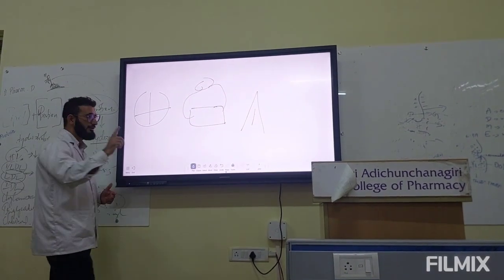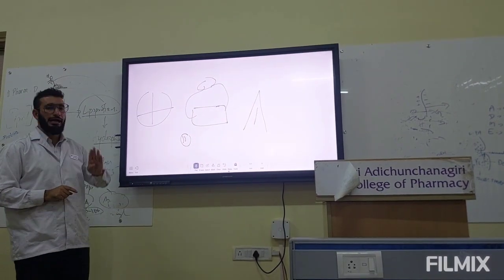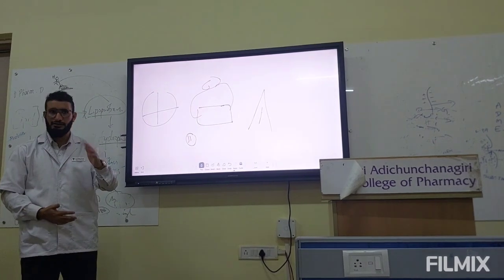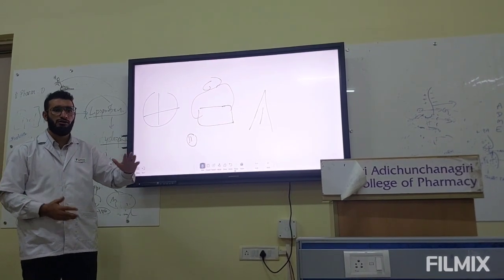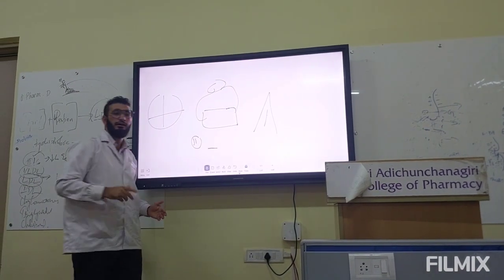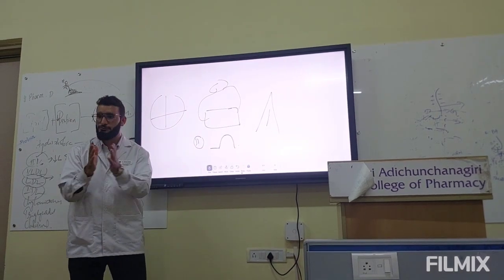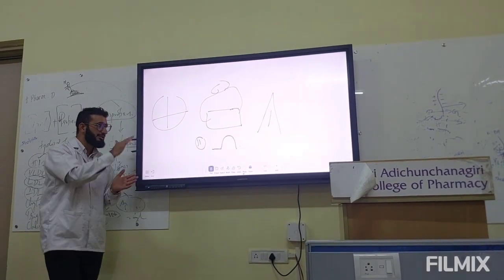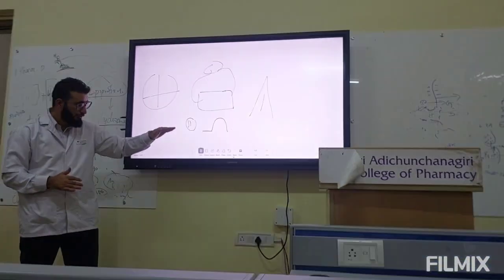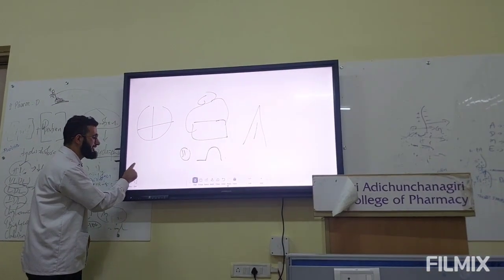Okay, rule number 1. Rule number 2. Then I told you the atria, as compared to ventricle, is not fast and produces a small current. So it's going to induce gradual deflection, because it's producing small current and it's not a fast conductor as compared to ventricle. So it's going to induce gradual deflection. The needle will deflect like this.